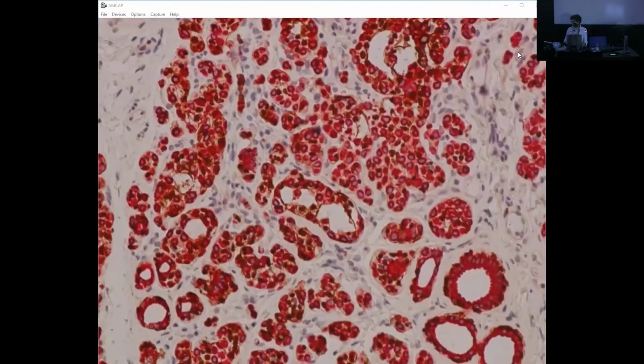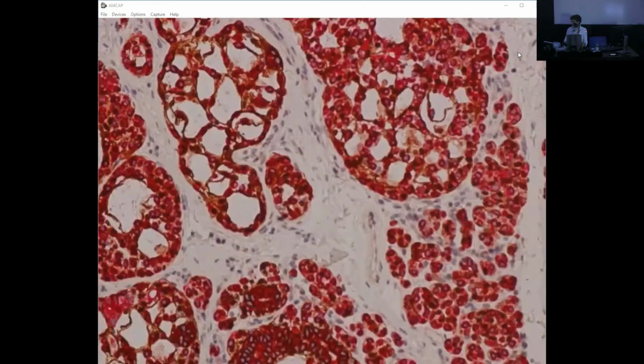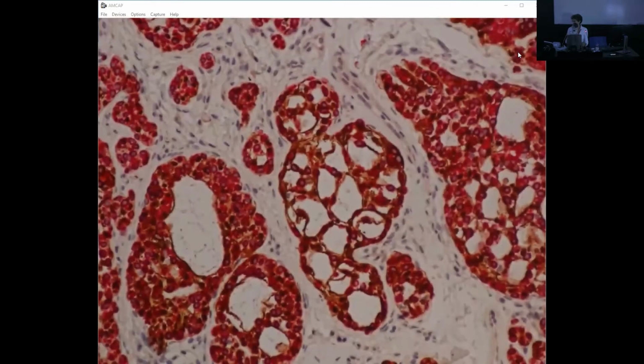And there is a lot of hyperplasia of the myoepithelial cells occurring. Oh, flip to the condenser. Thank you. And again, all these floating edges of collagenous spherulosis. So if you see that in a low-grade DCIS, that's not a low-grade DCIS. The floating thing within the lumina is something that I will remember.